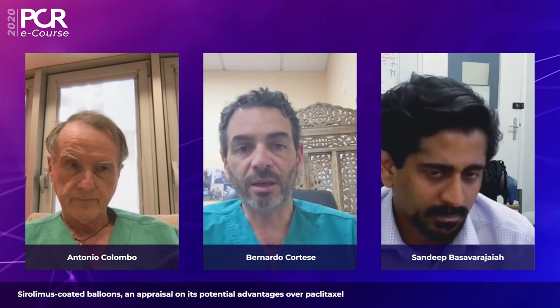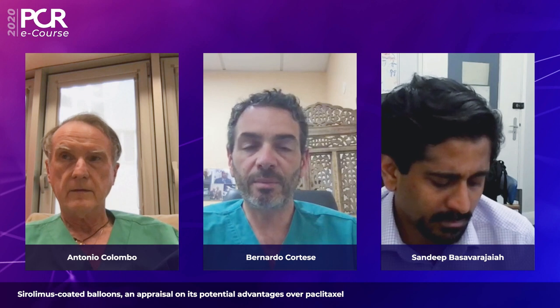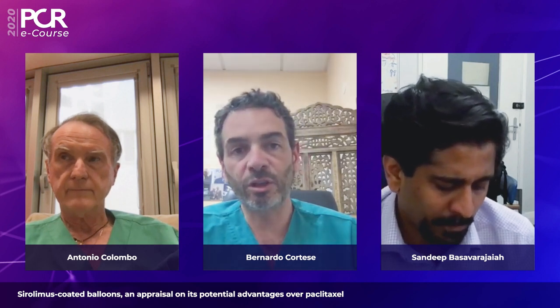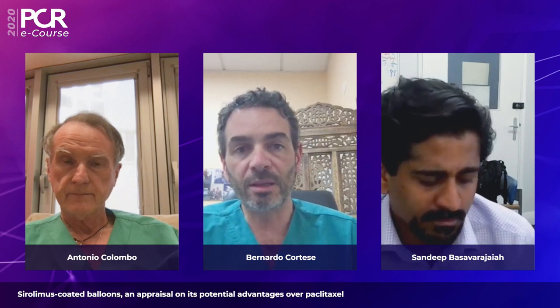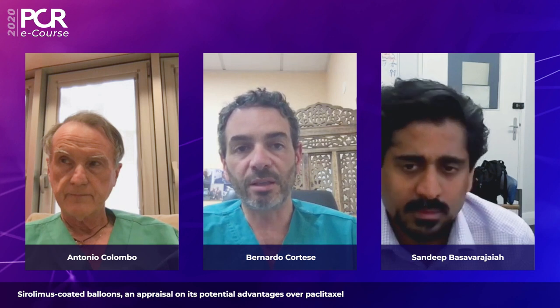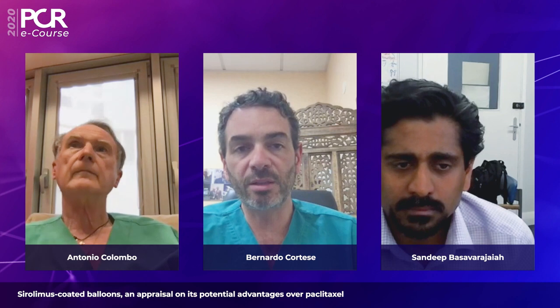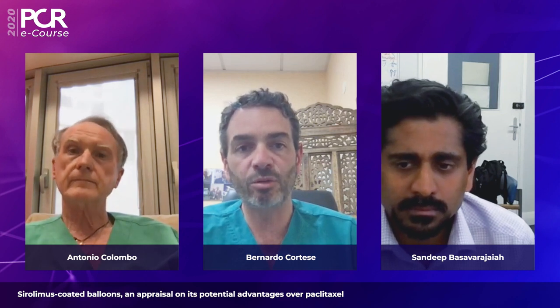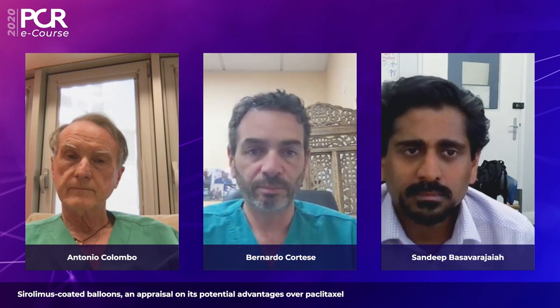I would like to ask Antonio one question. We have seen from the very beginning of our experience with Magic Touch that this device has very improved trackability and deliverability, so it is easier to use this device in more complex lesions. I would like to have your opinion on this, and whether you have extended the use of drug-coated balloons after Magic Touch came into the market.